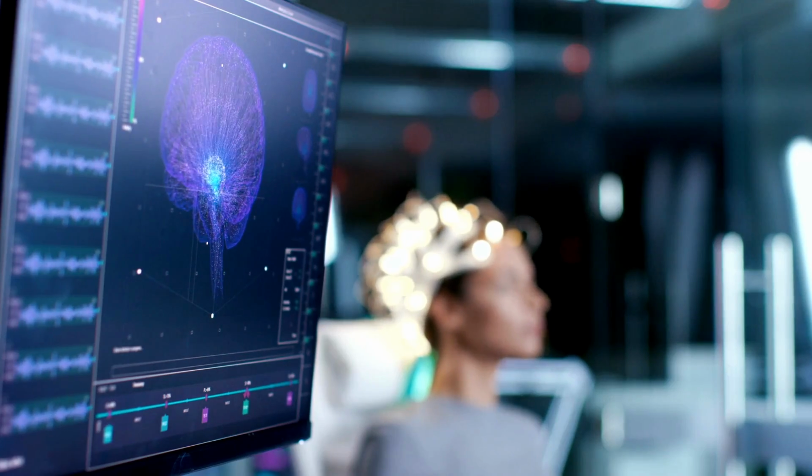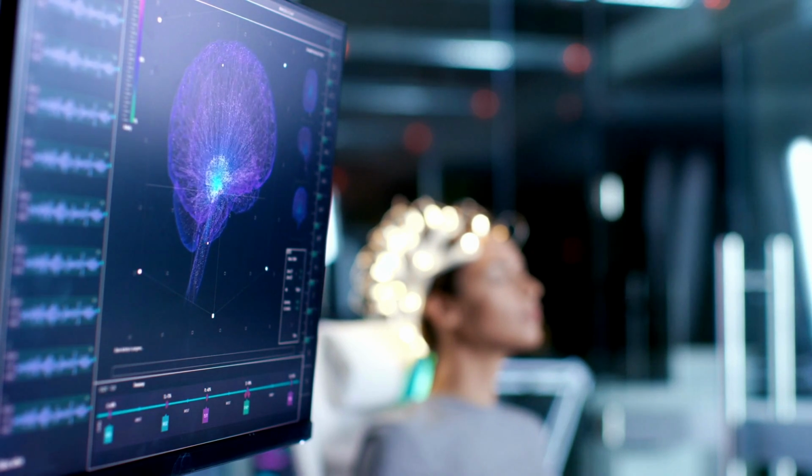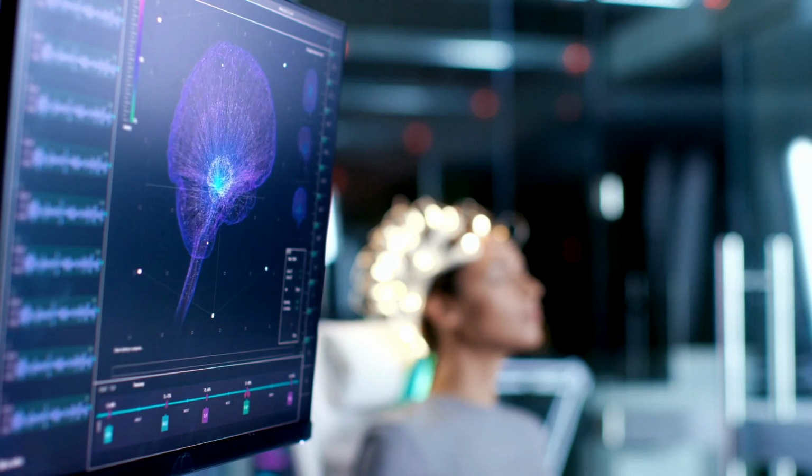So this is some more details on a QEEG. If you missed my other videos, a QEEG is an EEG with a lot of statistics, and it's used for neurofeedback. It's used to tell if someone is a good candidate for neurofeedback, but also guides treatment, guides what areas of the brain are going to be reinforced with certain brain waves or what needs to be inhibited.